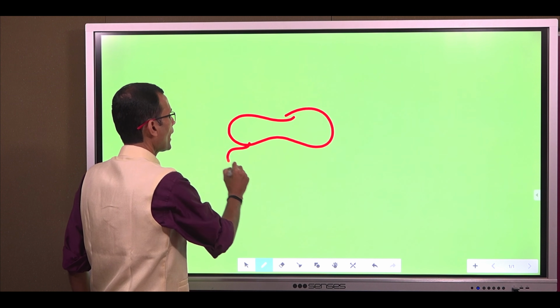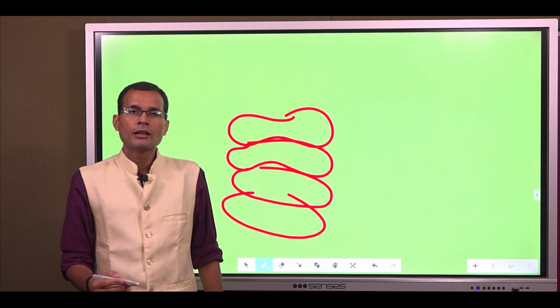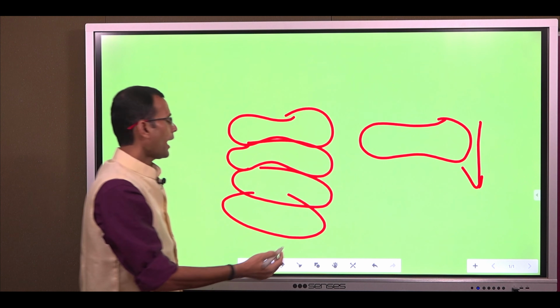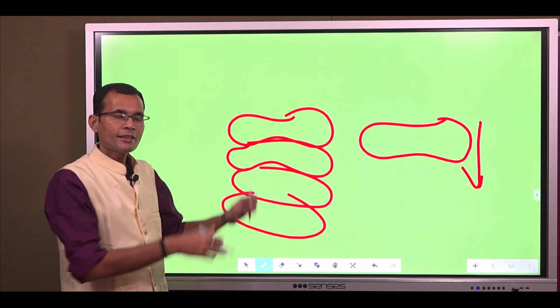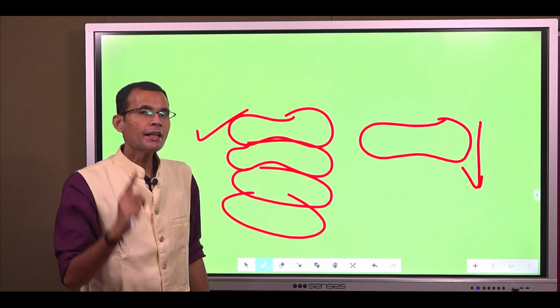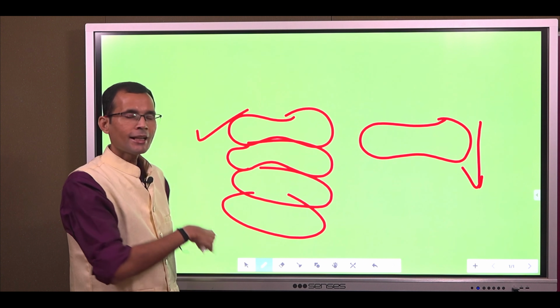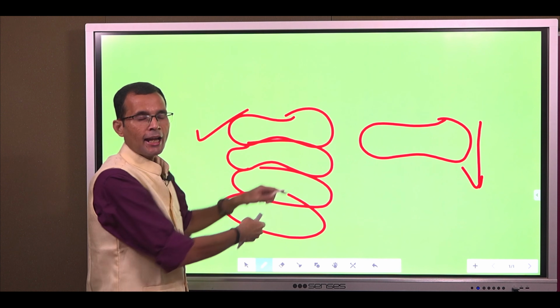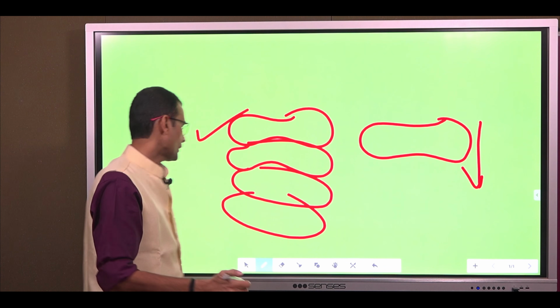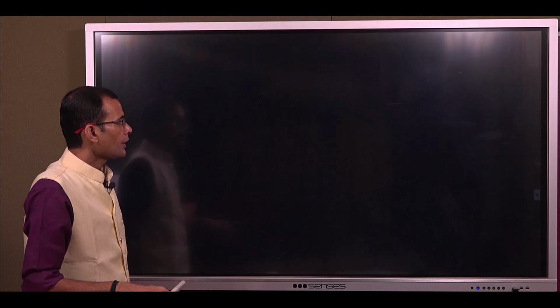So let's say 10 RBCs have formed a stack. Now remember, a single RBC settling down versus stacks of RBCs settling down, this of course will be much faster. So any factor that hastens the rouleau formation, any factor that accelerates the stack formation, will also increase the ESR, obviously. So that's the first stage in the sedimentation.